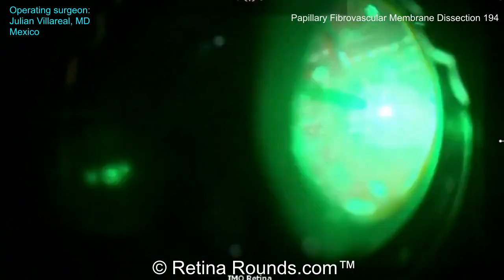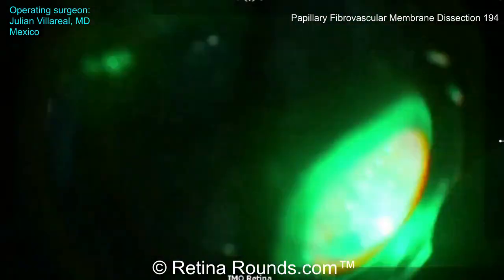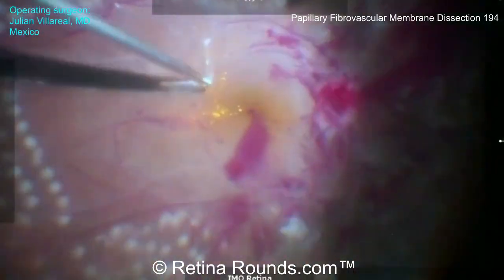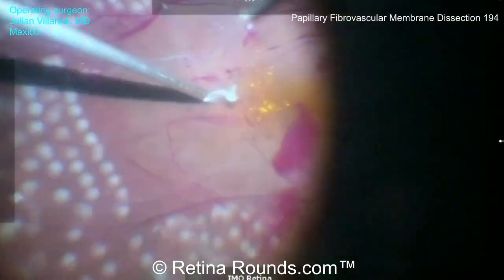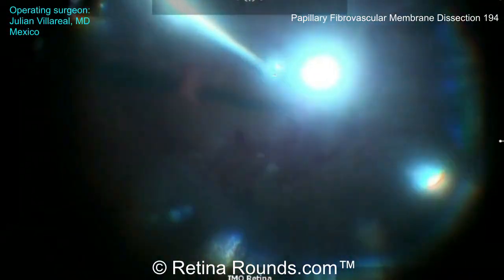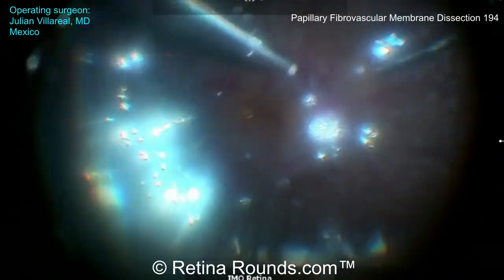The PRP is being applied quite efficiently, perhaps a little bit more posterior than I typically prefer. I'll usually leave about a disc diameter between the arcades and the posterior extent of the PRP and about two disc diameters nasal to the optic nerve. More posterior PRP can always be added postoperatively in the clinic, but during surgery it's most important to achieve a thorough anterior application of PRP. Finally, an air-fluid exchange is performed, which helps to clear any residual blood and provides a tamponade to any small oozers, and that concludes the case.